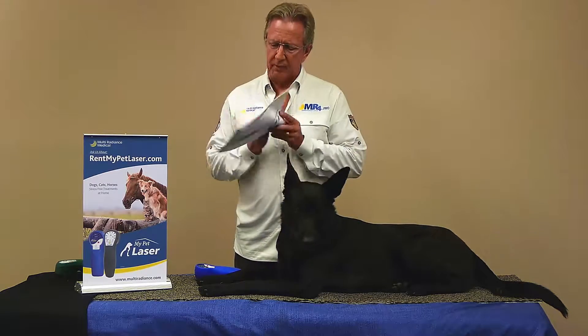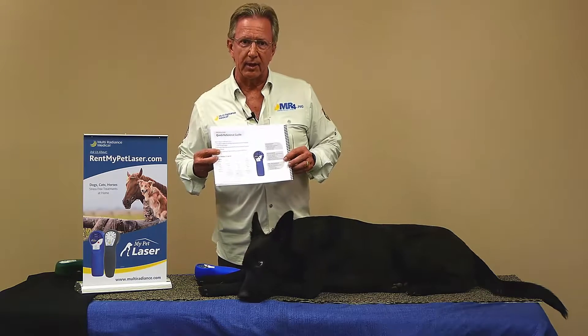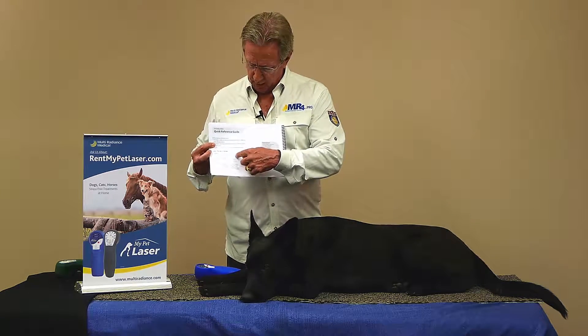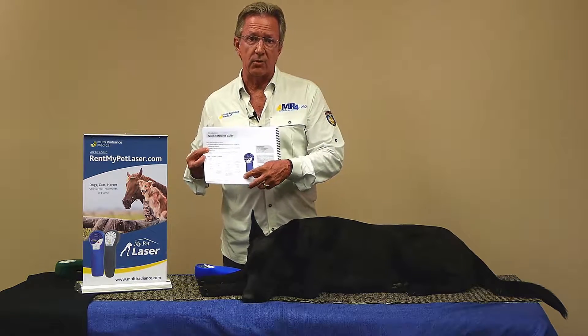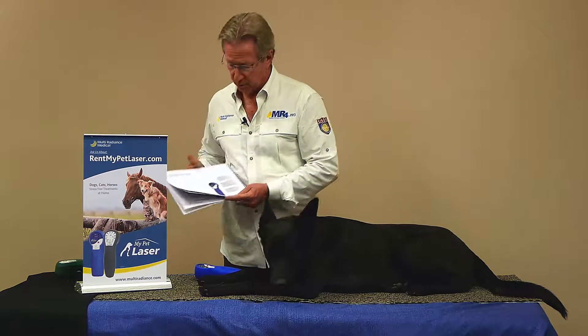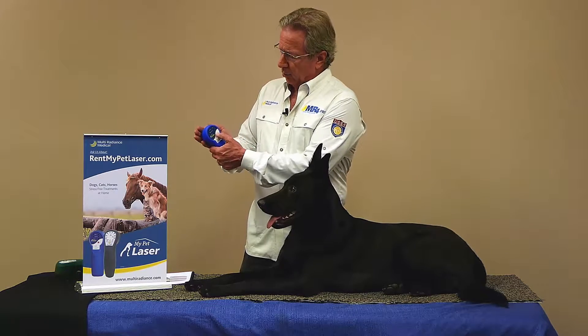Open up to the quick reference guide and this tells you exactly the three different protocols that can be used. These address issues like 50 Hertz for inflammation, 250 Hertz for tissue repair, and 1-3,000 Hertz for pain and swelling. Three separate controls makes it very, very easy to use. One of our favorite protocols is the unwind protocol.